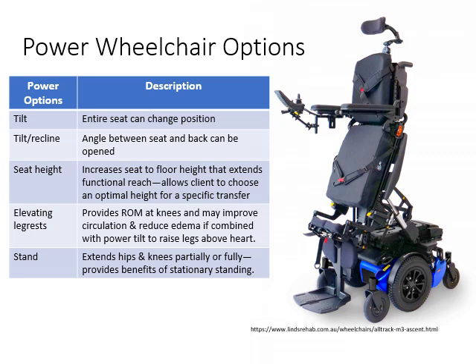There could be elevating leg rests that help to improve range of motion at the knees, to decrease edema, especially if combined with a tilt. So that's to help get the blood back to the heart by raising the legs above the level of the heart. And there are power chairs that will even transform into a stander. So here is a picture of a power chair that comes to a full upright standing position.